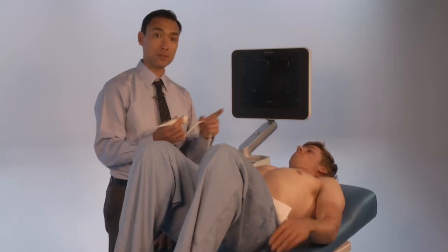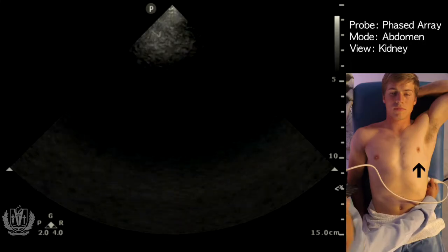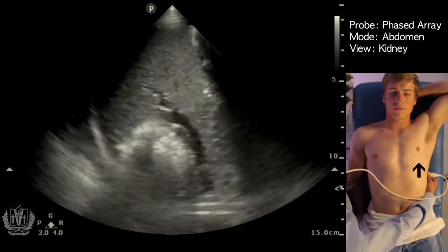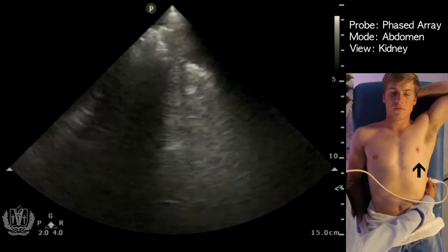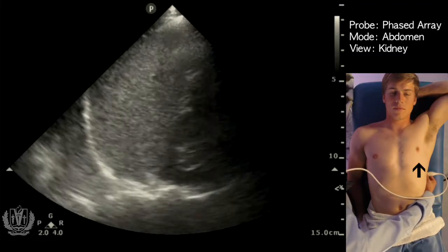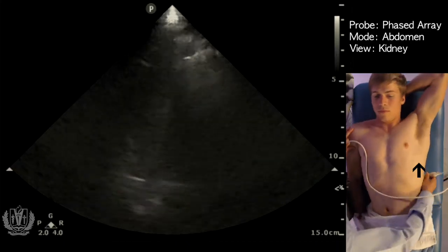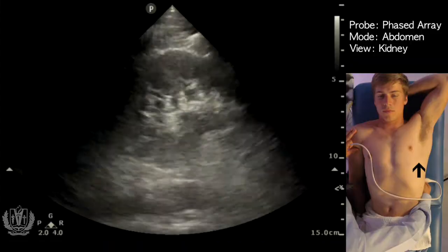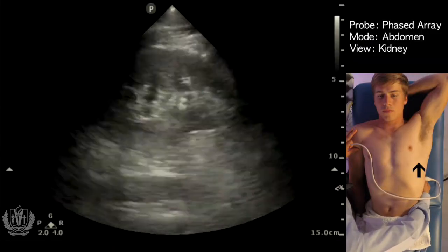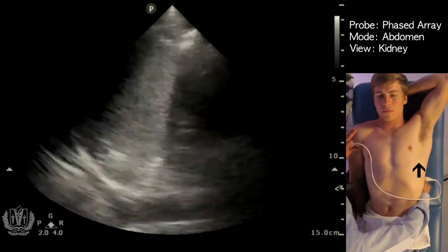For the left kidney, the indicator is going to be up towards the patient's head. You're going to be at the posterior axillary line — knuckles to the bed — and the kidney is going to be right below the spleen. Here we see the superior pole of the kidney. His kidney is very posterior, so I had to have him move a little more off the bed to get the full kidney.